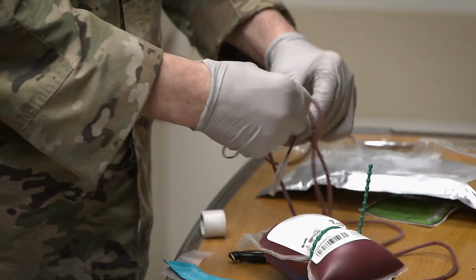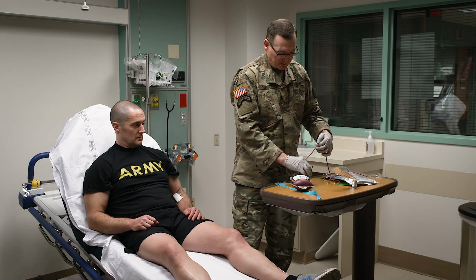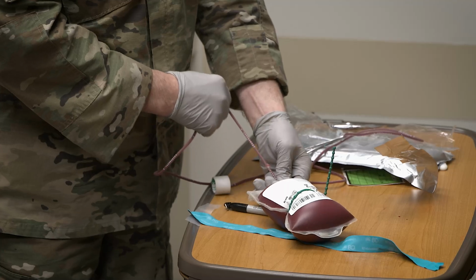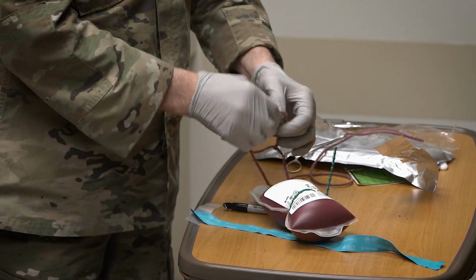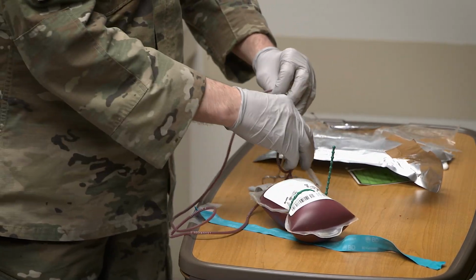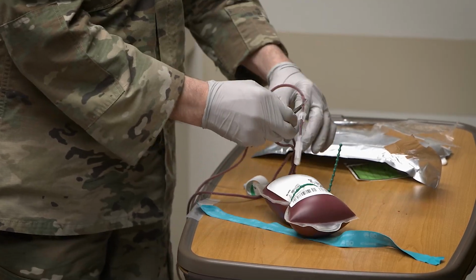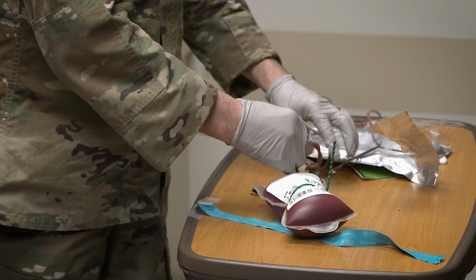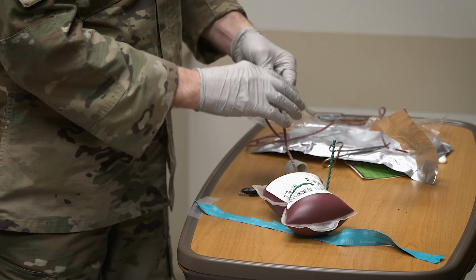There's no one way to do this. I've seen it done a number of different ways. As long as you're able to get the knot, 2 knots in here, that's the goal. It's easier if you tie the proximal knot to the bag first.